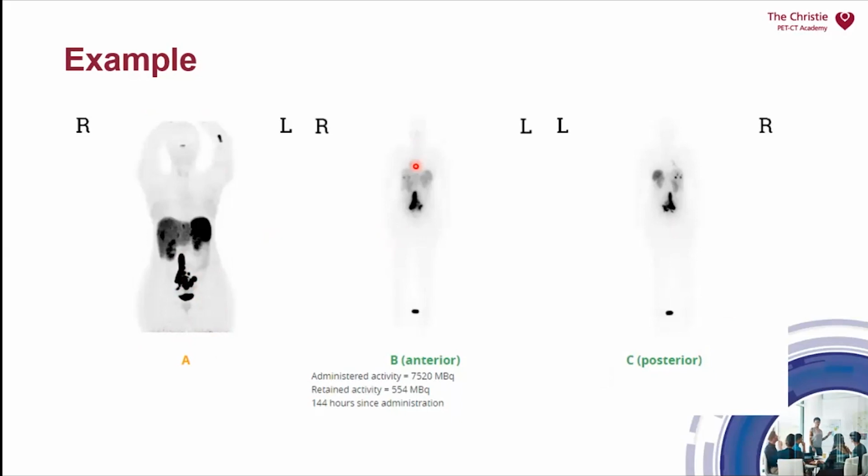These are the post-treatment images of the same patient, where the lutetium, which is the PRRT agent, has been injected, and we do scans afterwards to see where it's gone, and you can see it's gone to exactly the same place. And we kind of know it's going to do that before we do this, but we always do the post-treatment imaging to check. And that exemplifies the principle of, if we can see it, we can treat it.